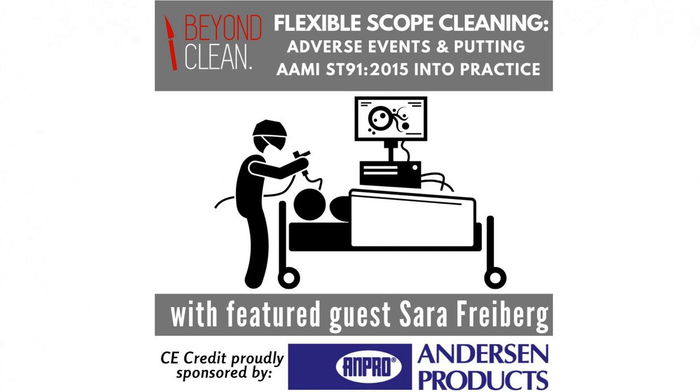As soon as that scope is fully submerged, the first step to the leak test entails flushing all lumens to remove any and all trapped air. Per the manufacturer's instructions for use, any air bubbles may inhibit disinfection of those channels. And I often hear users that are not aware of this step. Or maybe they flush one channel one time and there's still trapped air in those channels. So we should flush until no more bubbles emerge from the channels. And depending on the size of the scope, this may take several flushes with a syringe.